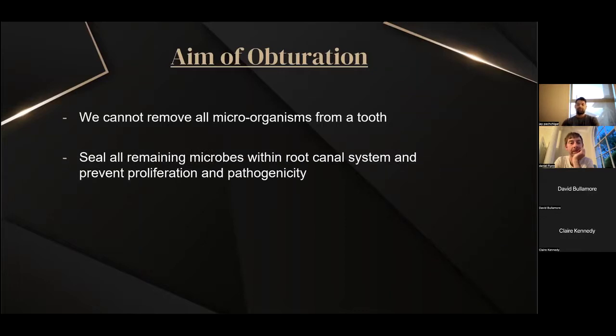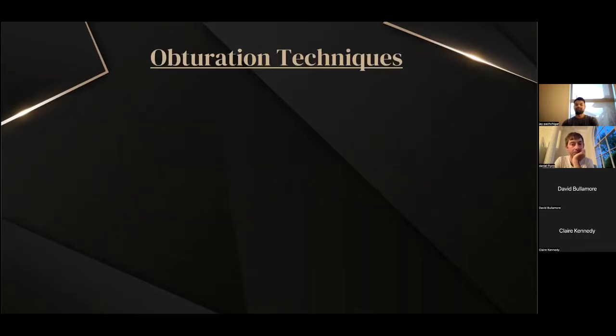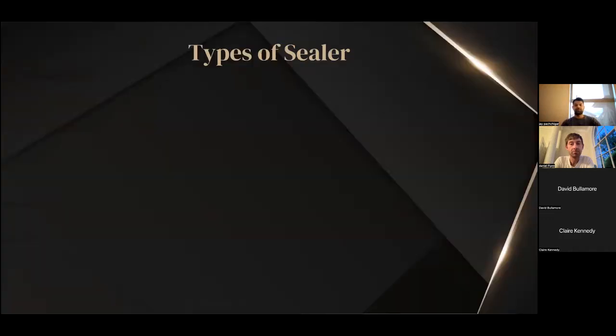So the whole aim of obturation is to make sure that anything that we can't reach stays there. We want to try and entomb these bacteria within the root canal system, and make sure nothing new gets into the root canal as well. So how do we do this? Very simply, we just use GP and sealer. GP has been around for a very long time, and other things like silver points and Resilon have come and gone, but GP is likely here to stay. And sealer, there are a few different types, so we'll go through that first.